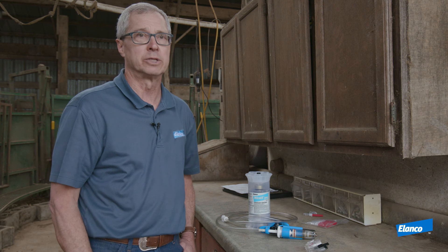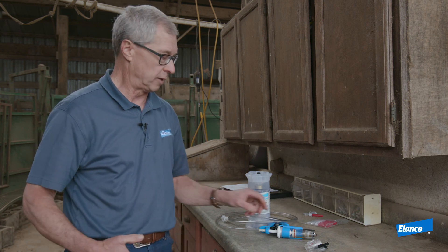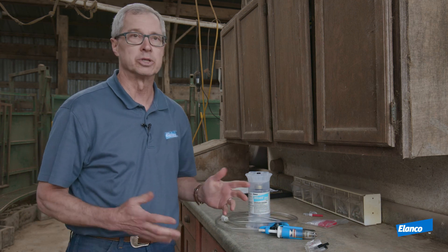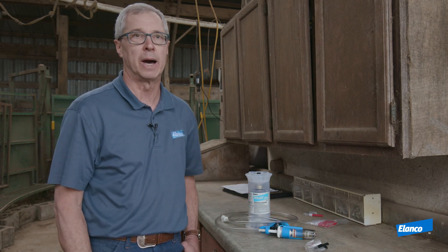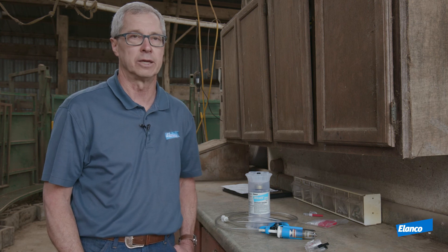Thank you for choosing Micotil for your use in bovine respiratory disease. If you have questions on cleaning the syringe and the tube, please refer to the instructions in the box that comes with your safety syringe. If you have questions about Micotil, please contact your Elanco sales representative. Thank you.